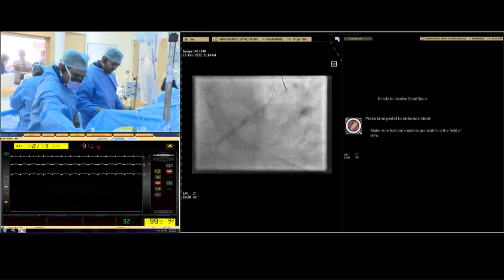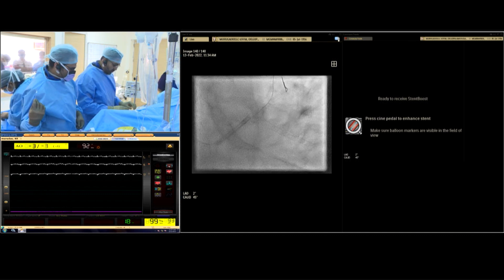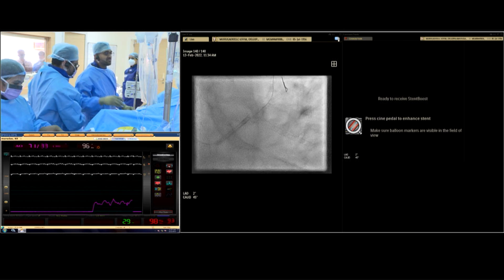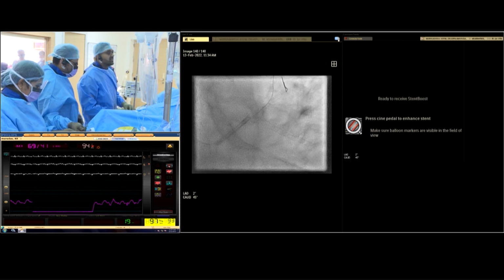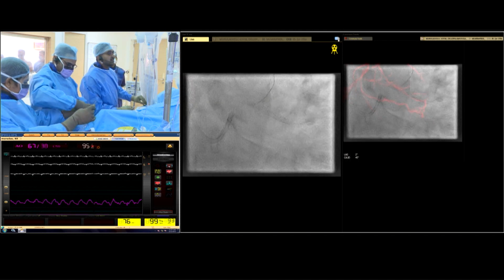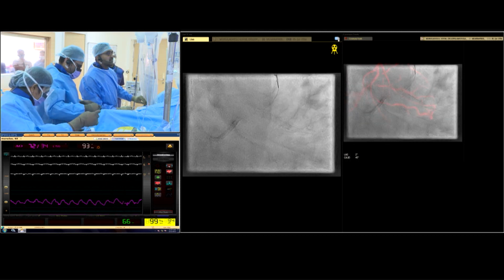now, and then we will treat the LAD, and then we will open the stent struts, perhaps. Gopal, it's interesting because I've seen some operators, they will put the LAD balloon way down distally when they are putting the side branch stent. I'm always scared it might get caught.